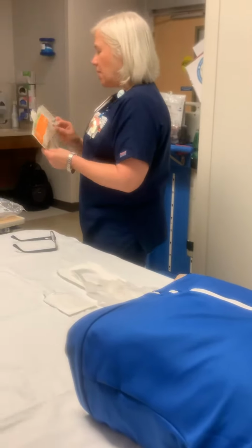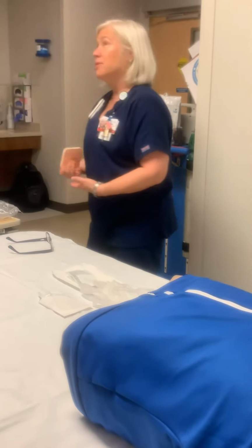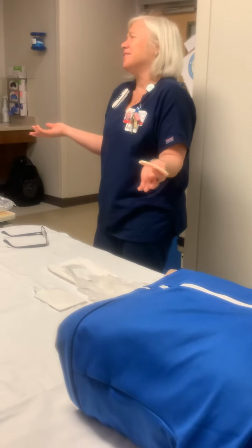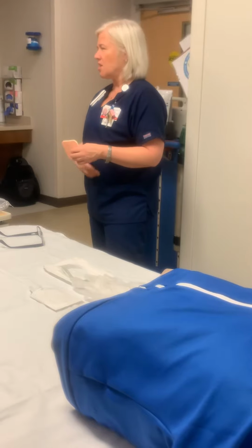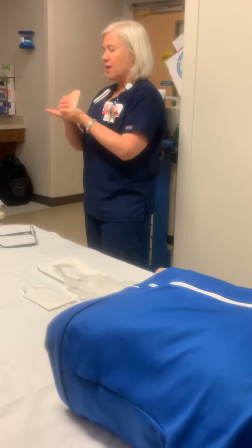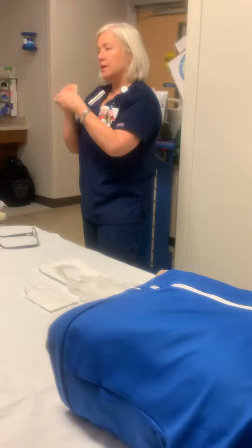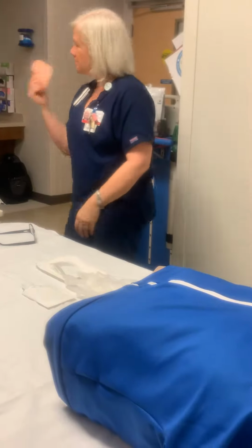I got called over to the infusion center once by clinical nutrition. They said, Lord, we've got this peg tube that's draining everywhere. And I'm like, well, maybe the balloon's not inflated. It needs to be. She says, no, it's inflated. So I popped over, it was just all excoriated. It was looking pretty bad. We cleaned it and put this underneath there, and it provided a bolster. So it kind of pulled it out a little bit more, and also helped with the excoriation, and it stopped leaking. These things are amazing.